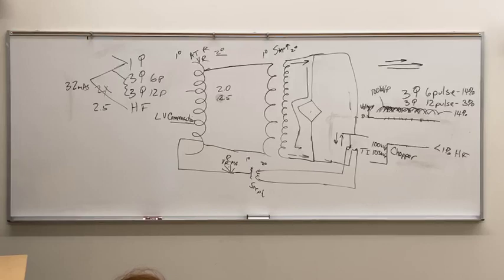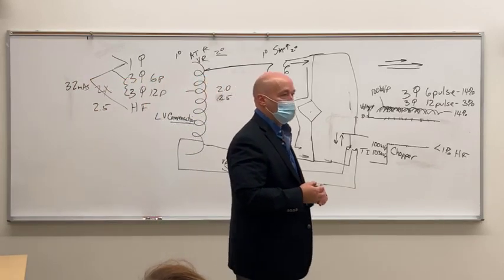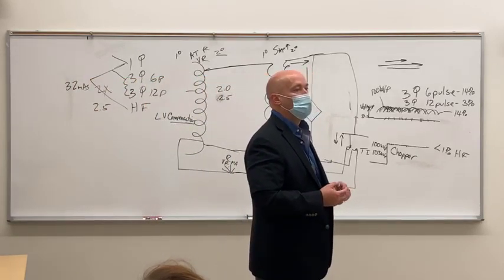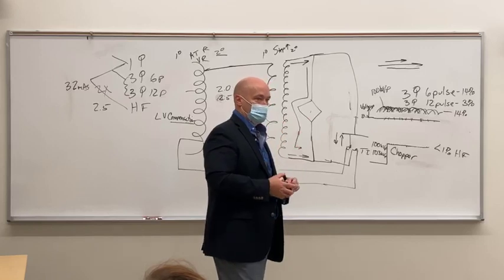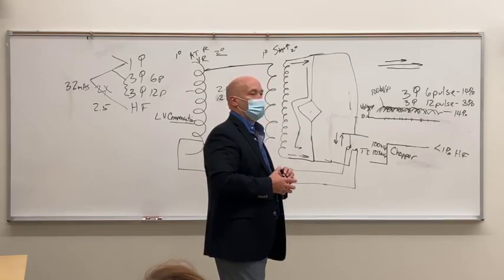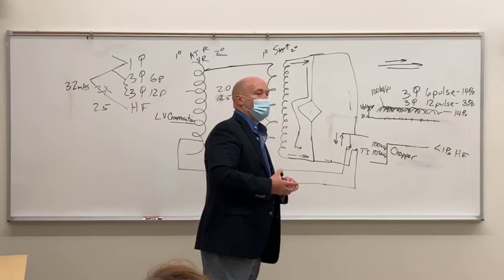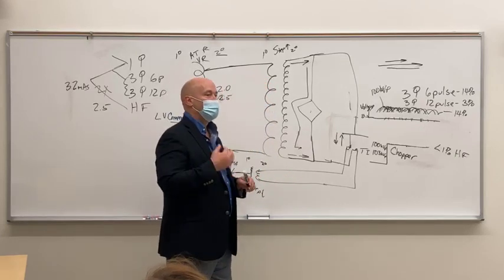All right, so do we have any other questions on all this? Just real quick, if I go from a 1-phase to a 3-phase with 6 pulse, I'm changing it by a factor of 2. Yeah. If I go from a 3-phase 6 pulse to a 3-phase 12 pulse, it doesn't matter because it's 25% difference. And then from a 3-phase 12 pulse to high frequency is 2.5?